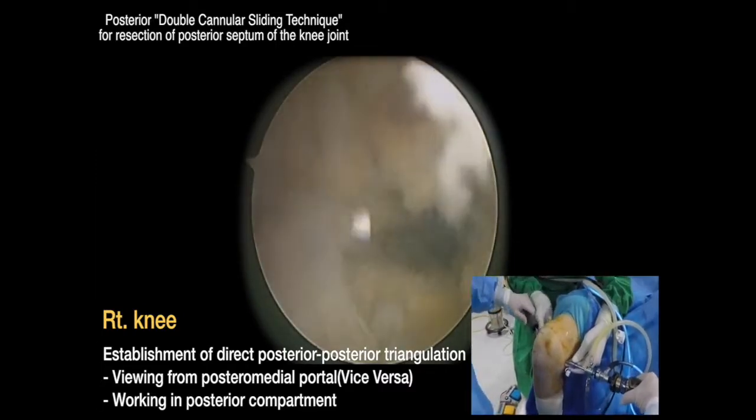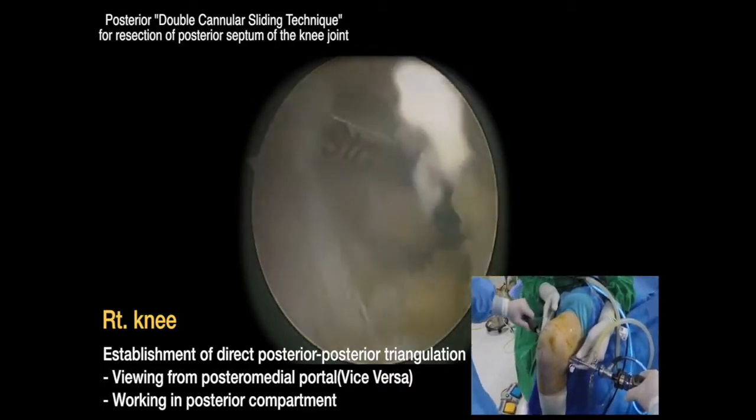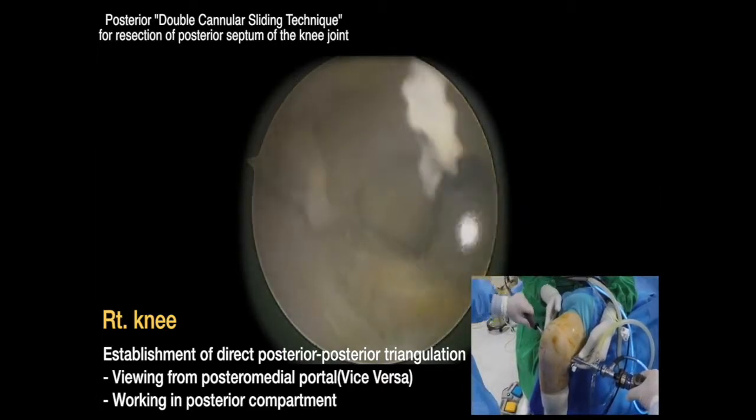Exchange the arthroscope between the posterior medial and posterior lateral portals. Now the posterior septum resection is complete.